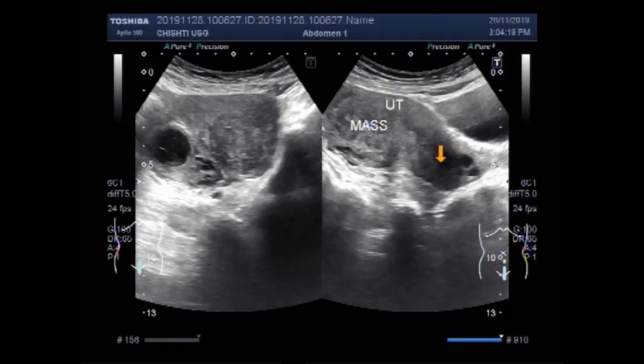This is the fibroid. This is the cervix, and these are a couple of small cervical cysts. This is the urinary bladder.